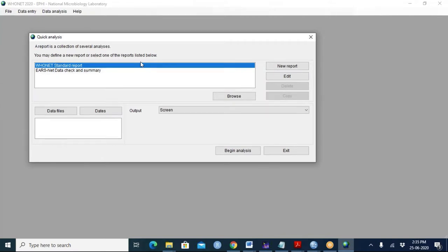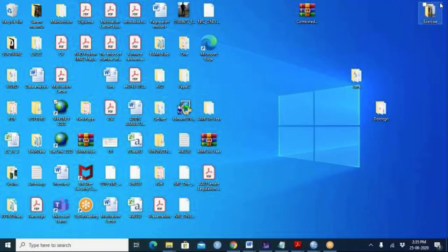Well, why don't we start by this? Click on exit. Because of the performance improvements, I'd like to put in the new software. So click, no, not edit, exit. Perfect. Close that and exit. Leave WHONET completely. I want to update your WHONET, so let's go to the WHONET website.